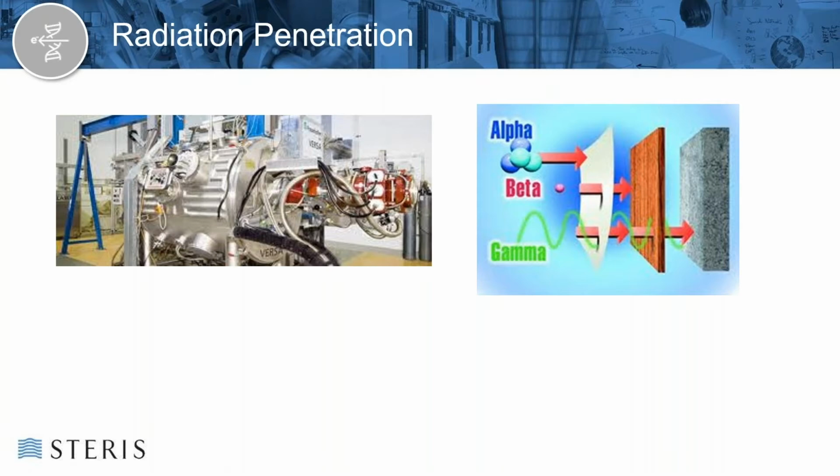Those beta particles can certainly have a range of energies. Different isotopes would emit betas at different energies, characteristic energies of that decay process. And the beams, the machine sources we use, emit electrons at a certain characteristic energy that we measure in terms of millions of electron volts.